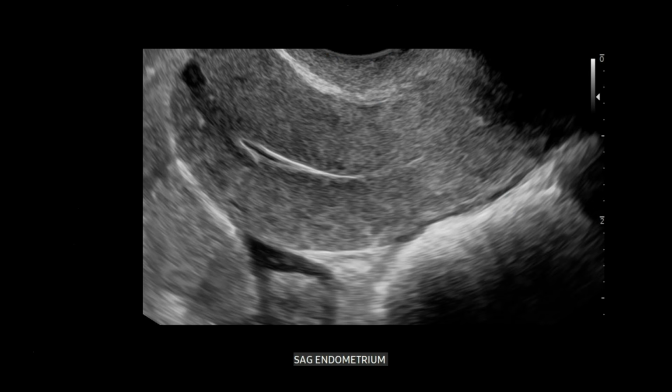This was a postmenopausal patient, and you can see that's why the endometrial stripe is quite thin. We don't see any thickening there, no evidence of a polyp at this level. Here's the fundus in the uterine body. There is some trace fluid in the endometrial cavity, but it looks simple. However, the patient did have a history of a pedunculated mass at the cervical os on pelvic exam, so that's this region here, which is obscured by shadow.